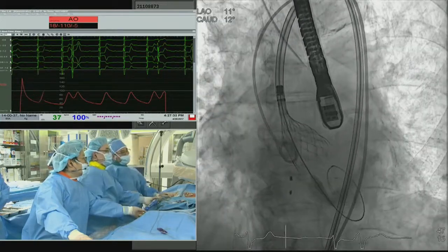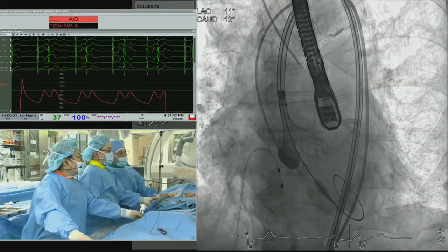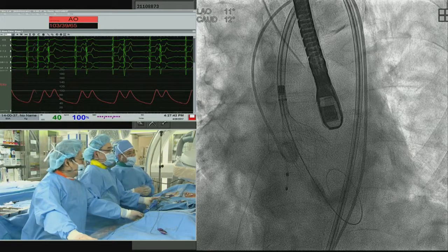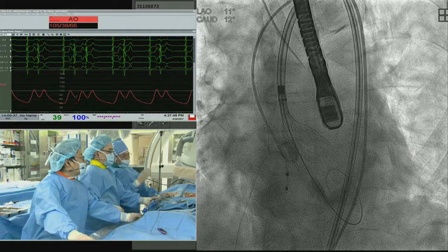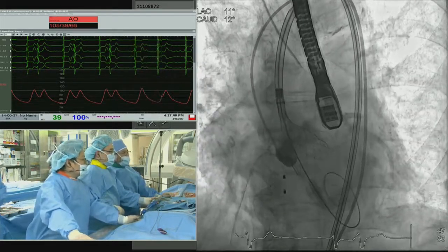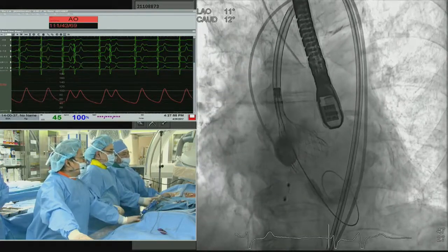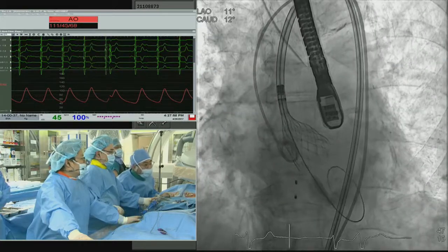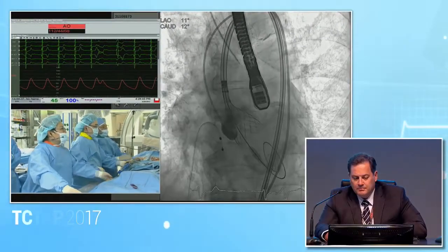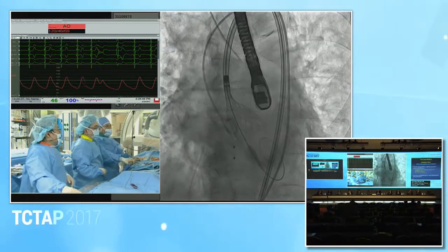It's a little bit deep. The only problem with that strategy with a CoreValve is it may force the non-coronary deeper, and it may not pivot if it's trapped by the calcification. Even though I started the NCC side very shallow, the final position is relatively deep, so I will start recapture and repositioning again. Do you agree, or do you think it's okay? Well, the question I want to assess is, do you have any paravalvular leak? Unluckily, the patient developed complete AV block, so we stop and then recapture.